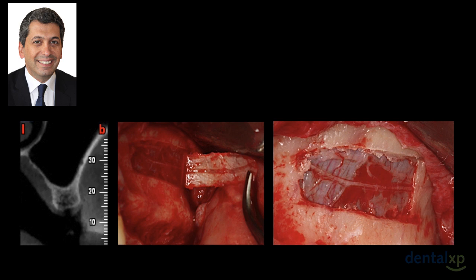You can see it here clinically. You can see radiographically on the left the artery in the thickness of the bone, and once we cut this bony window and took it out, you can see the path of the artery in the thickness of the bony window, and you can see the actual artery here that is in very close contact with the Schneiderian membrane.